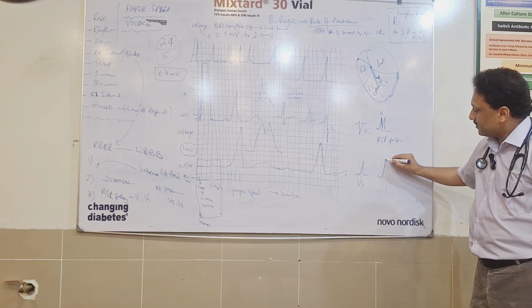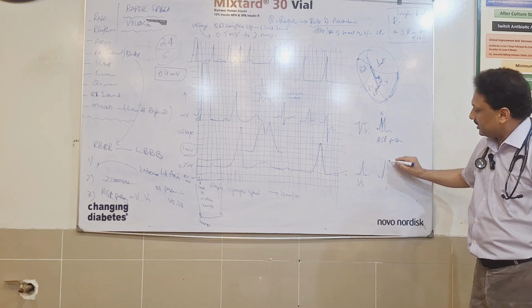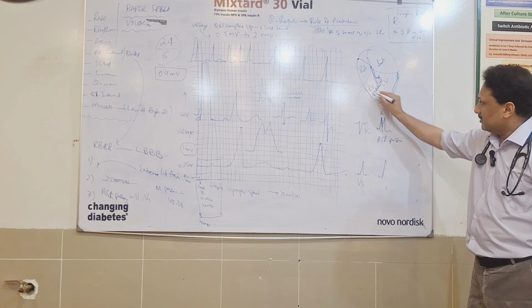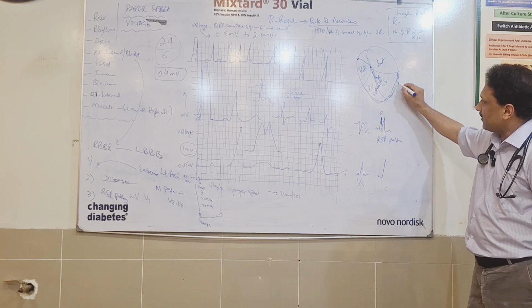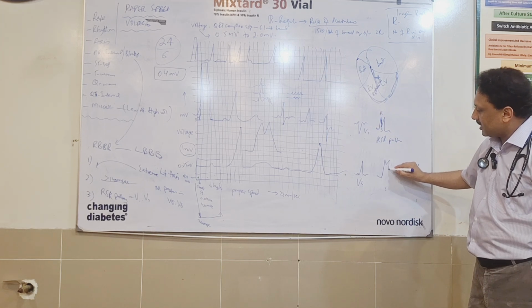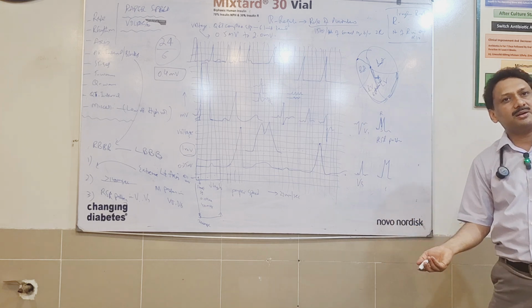There is a waveform because of the contraction of the right ventricle. As it was going down, it was supplied from the Purkinje fiber of the right ventricle to the left ventricle this time. Again, there is a contraction and it comes back again. You call it M pattern.